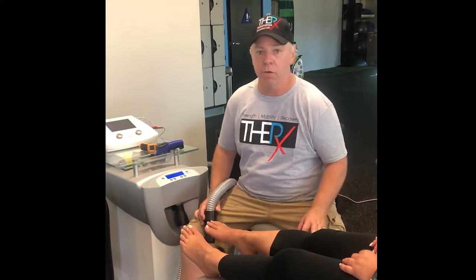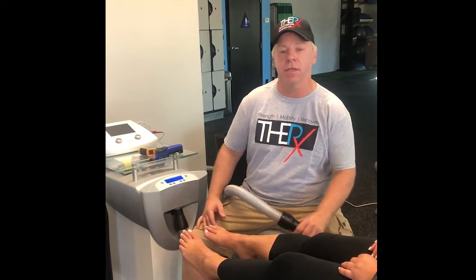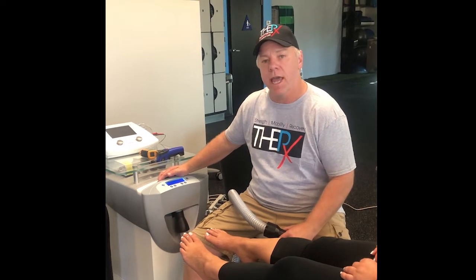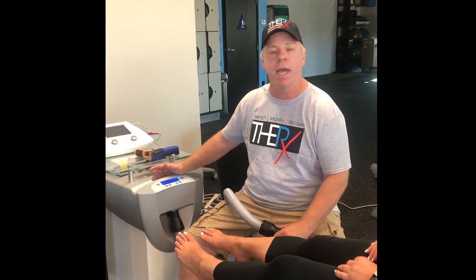Hi, this is Chuck Bagwell. I'm with Thera-X Performance. I'm a physical therapist and one of the great tools that we have here is the Cryo-6, which is constant cold. You have multiple speeds. It has different temperatures depending on the speeds and it can get down to minus 30 Celsius.